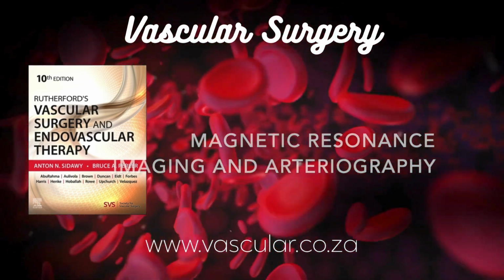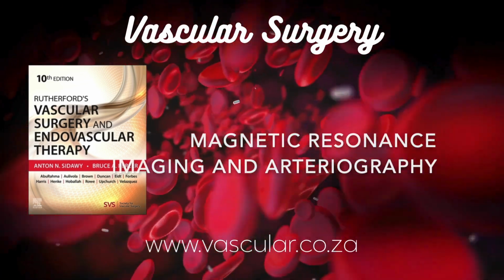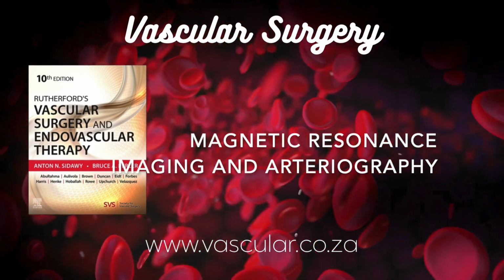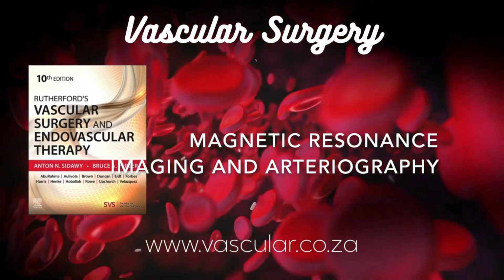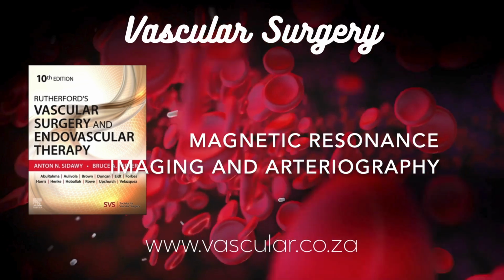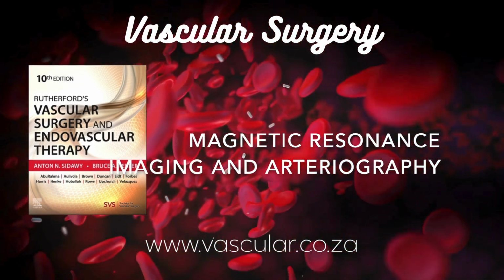The blood within the vessels where the GBCA is concentrated appears much, much brighter on the images than the surrounding tissues. So just to be clear, we're not actually imaging the gadolinium atoms themselves. That's a really crucial point. No, MRI detects the effect the contrast agent has on the surrounding water protons, not the agent itself. And what's the significance of that?